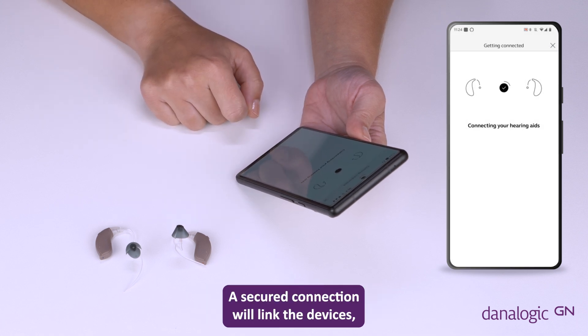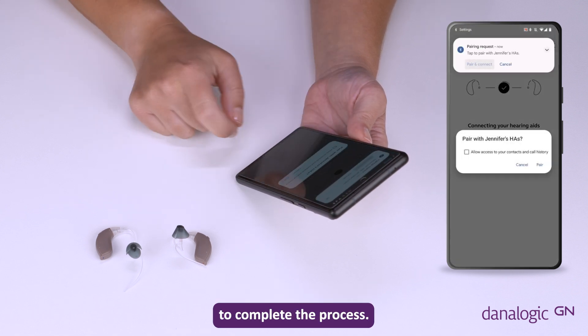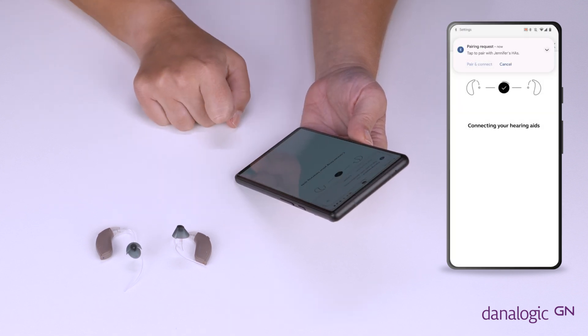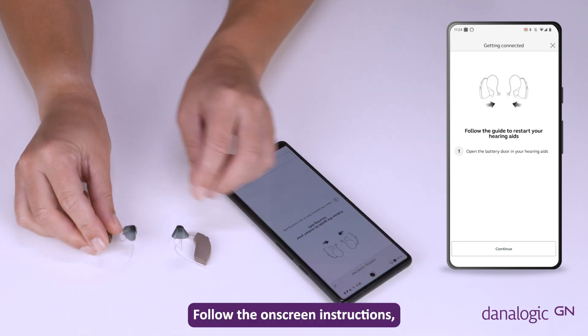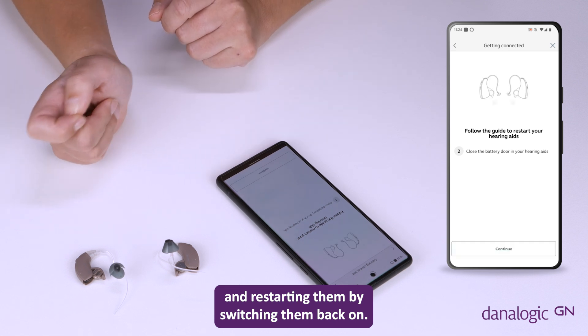A secured connection will link the devices, but a restart of your hearing aids is required to complete the process. Follow the on-screen instructions, turning off your hearing aids and restarting them by switching them back on.